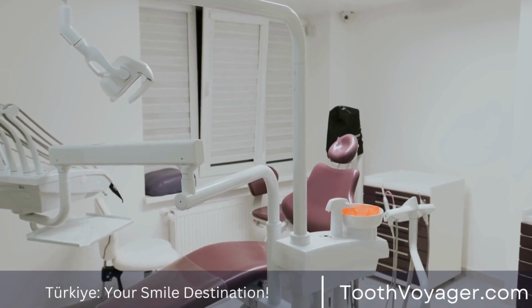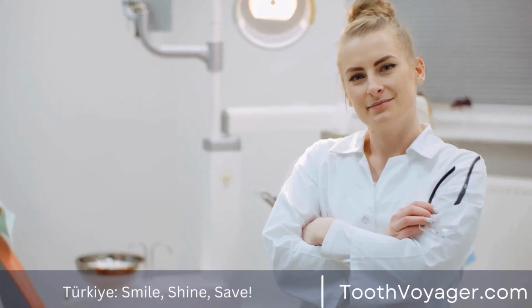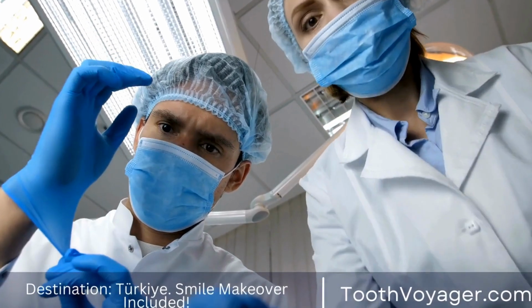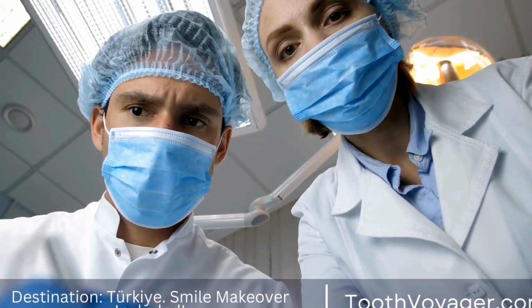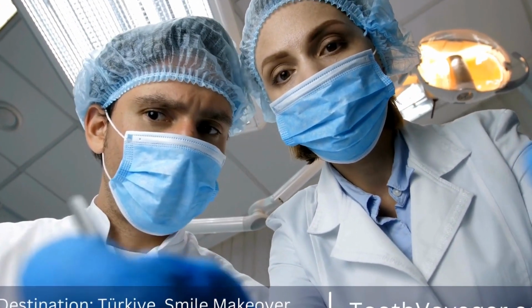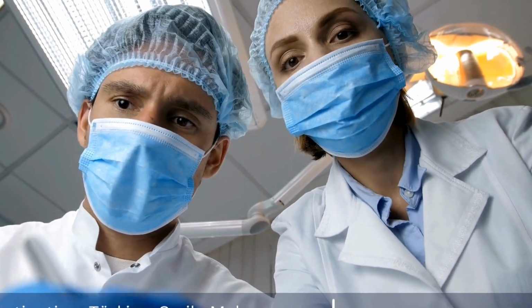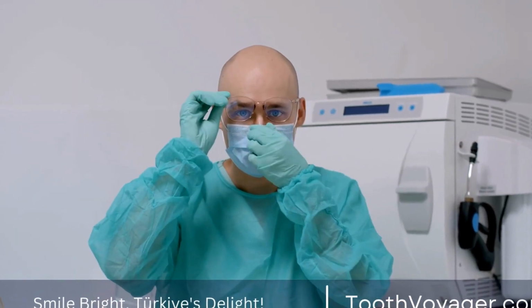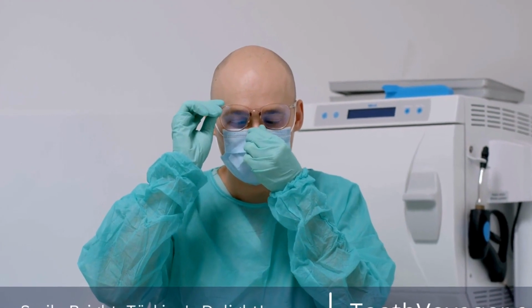What is bone grafting? Bone grafting is a surgical procedure that involves adding bone tissue to an area of the jaw where bone loss has occurred. This new bone tissue can be taken from the patient's own body, autograft, or from a donor source, allograft or xenograft. The purpose of bone grafting is to create a stable and secure foundation for dental implants to be placed.